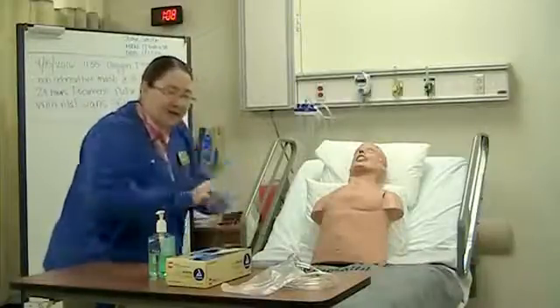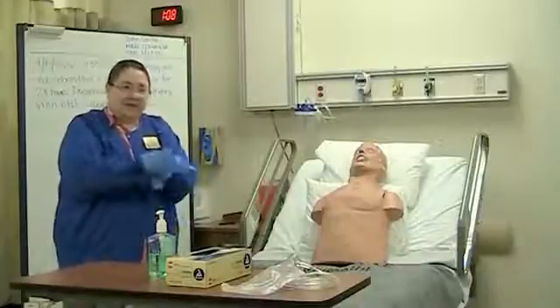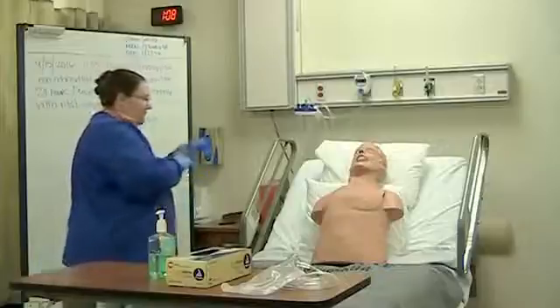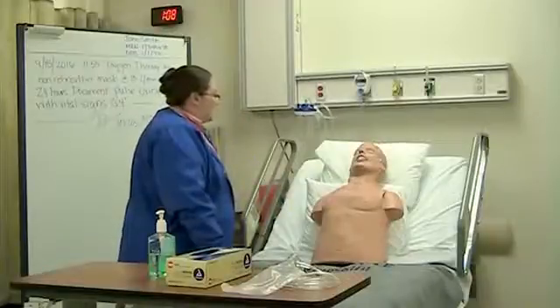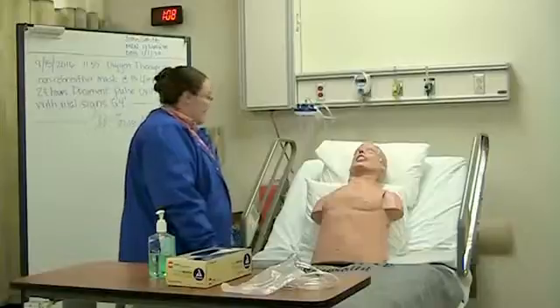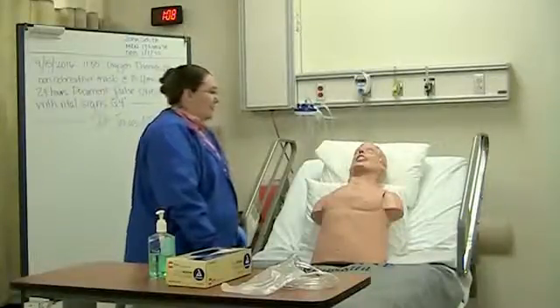Now that my hand sanitizer is dry, I'm going to apply my gloves and come in and greet my patient. Good afternoon, Mr. Smith. My name is Amy. I'm the respiratory therapist, and I'll be here helping to take care of you today. So the doctor has asked us to place you on an oxygen mask to help give you some extra oxygen while you're recovering here in the hospital.